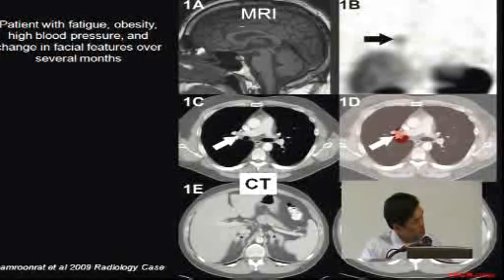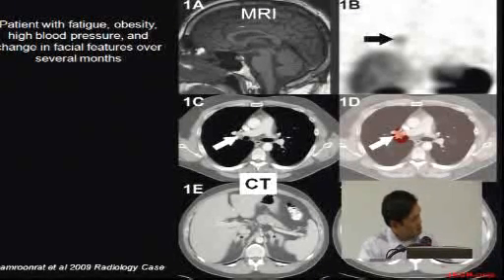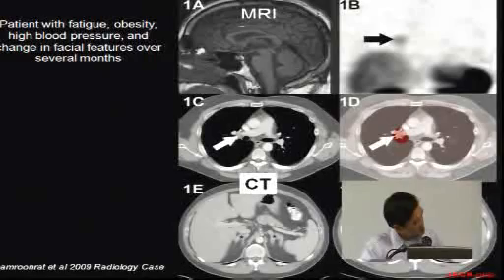So that's not normal in this patient. So, we found something already in this patient who presented these symptoms. And then, additionally, when we look down here in the abdomen, this is the liver, this is the spleen. These are more vessels.